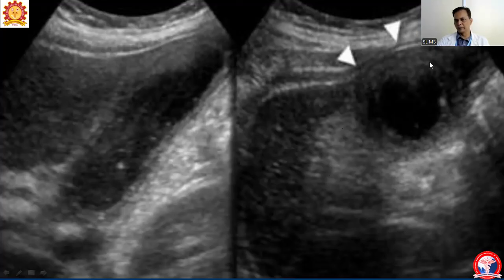How to determine this on the image is we can see the peritoneal layer is getting compressed here, abdominal wall to peritoneum. Here it is normally seen, but just in the region of the gallbladder it is compressed on the other side and showing less thickness here. Despite putting so much compression, the gallbladder is not getting flattened. Its shape is not changed at all. So this is an inflamed, stout kind of gallbladder with a thick wall.